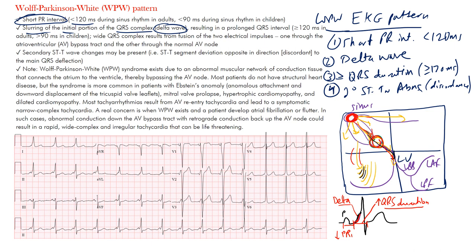Looking at this EKG example: you can see the P-waves here, and notice the short PR interval — it's less than 120 milliseconds, about 90 milliseconds. You can notice the slurring more in lead II — the slurring of the initial portion of the QRS complex. The P-wave is almost catching up to the QRS, confirming the short PR interval and delta wave. The terminal portion of the QRS is sharp, and the QRS duration was just about 120 milliseconds.